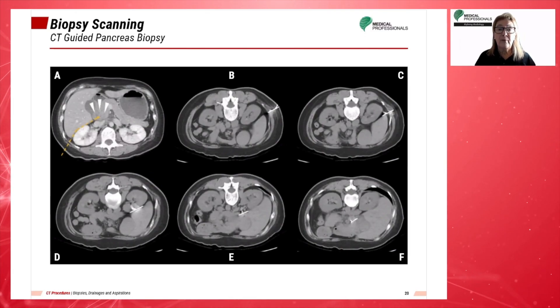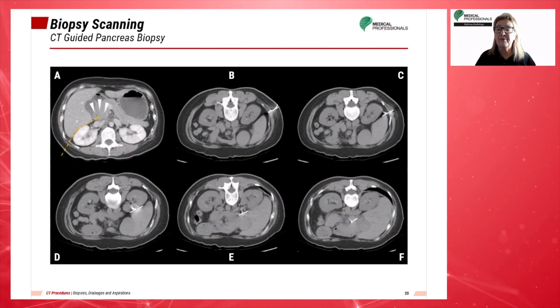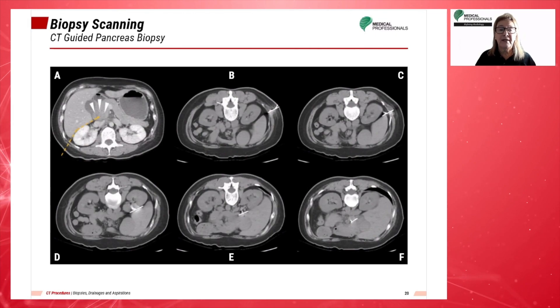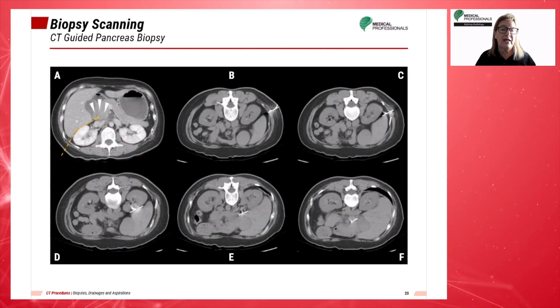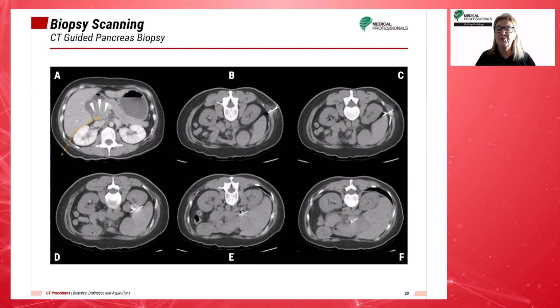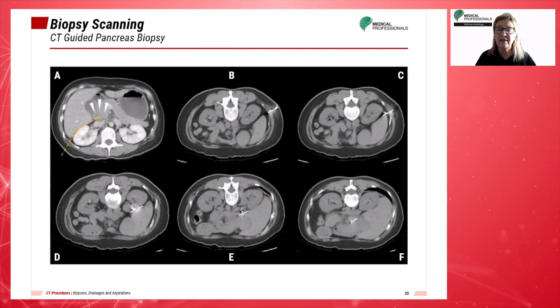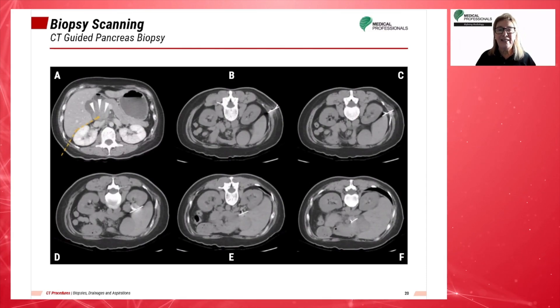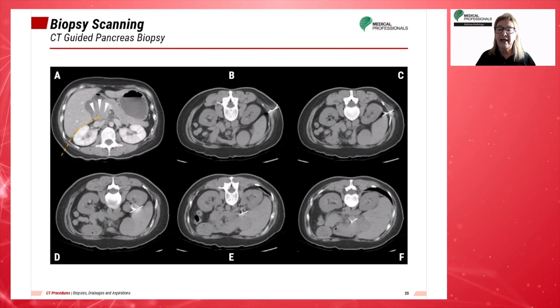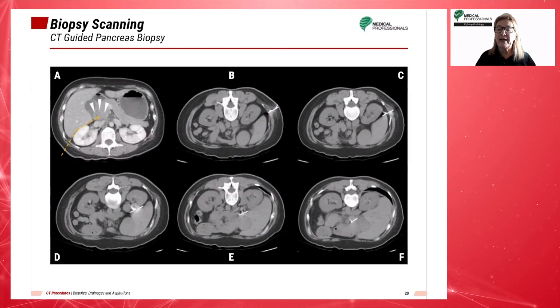These images come from a CT-guided core needle biopsy in a 51-year-old female with a pancreatic head tumor. In image A, we see a contrast-enhanced slice demonstrating a hypodense tumor in the pancreatic head as noted by the arrows. The detour route was planned to avoid penetration of the liver and kidney, which is shown by the dotted yellow line. In images B and C, we see a prone, non-enhanced CT scan showing the insertion path of the coaxial-guided needle through the fat between the liver and the kidney.